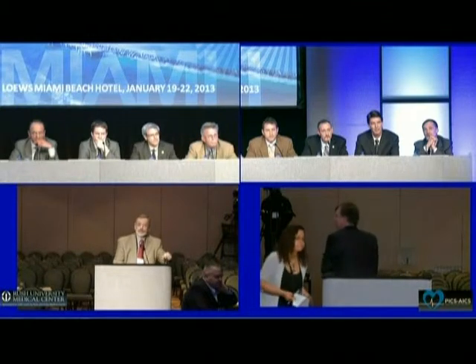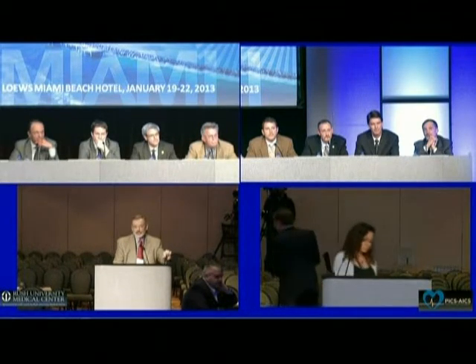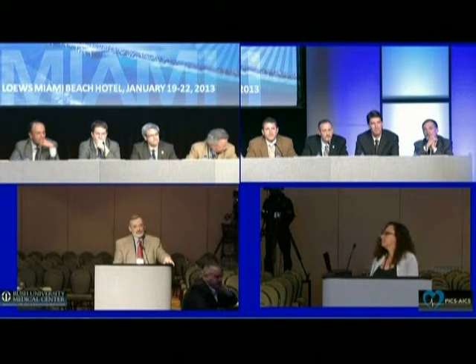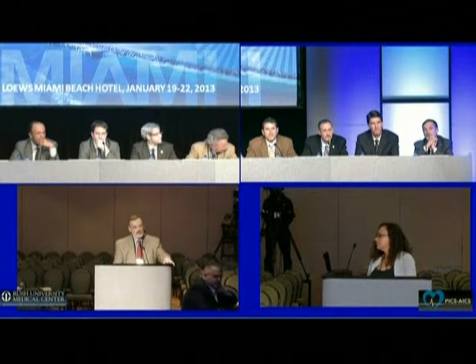Great. John, you have a question? Yeah, just a very brief comment for Dr. Carroll. I was thinking maybe you should put your fiducial marker on the end of a guide wire and stick it in the left atrial appendage to get rid of the problems with translation of the appendage during your angio.